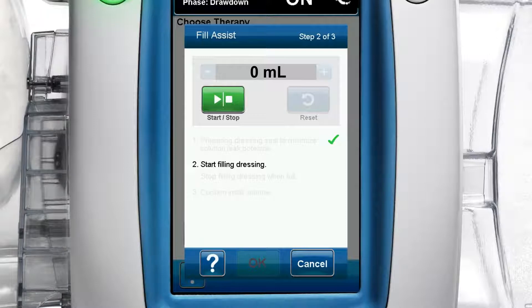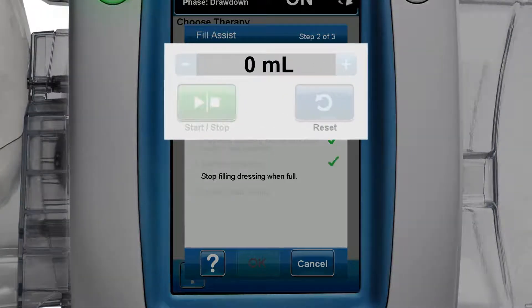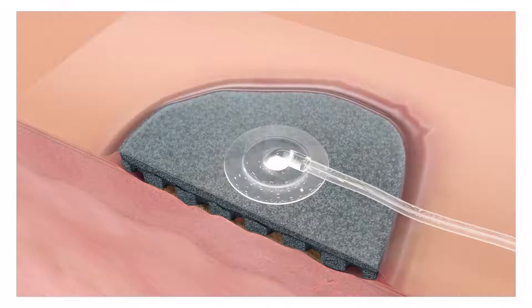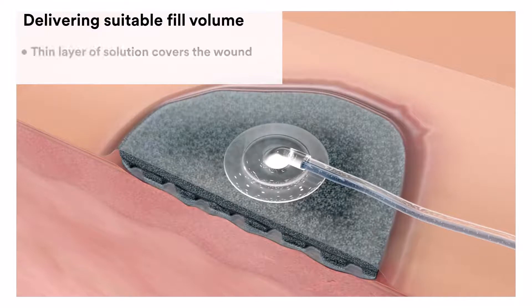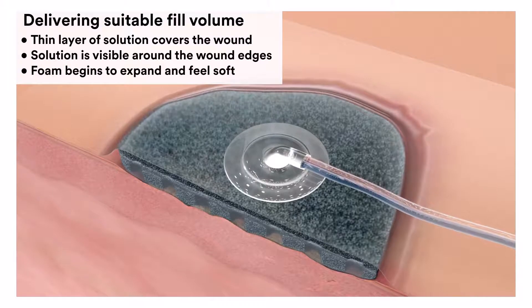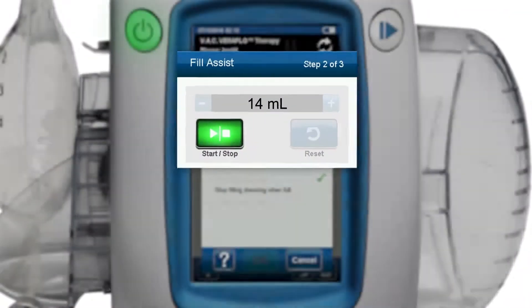Start filling dressing. On the fill assist step 2 of 3 screen, press the green start stop button to begin delivering solution to the wound. Monitor the wound as it fills with solution. Once a thin layer of solution covers the wound, is visible around the wound edges and the foam begins to expand and feels soft, press the start stop button to stop filling.